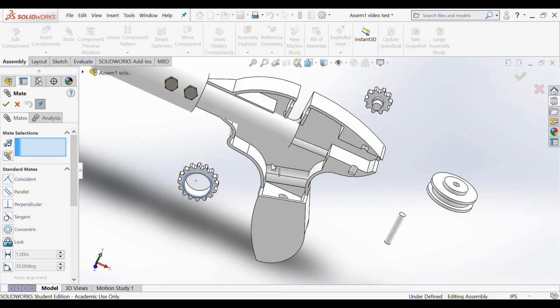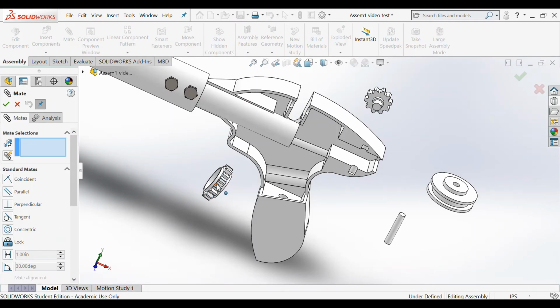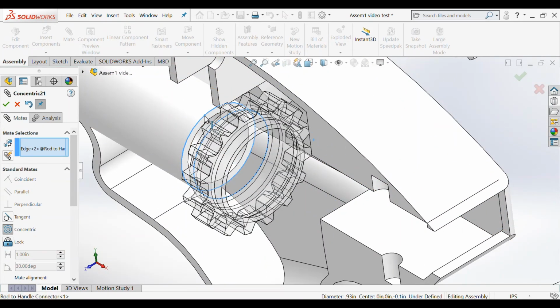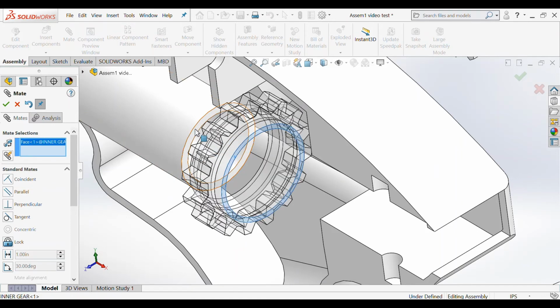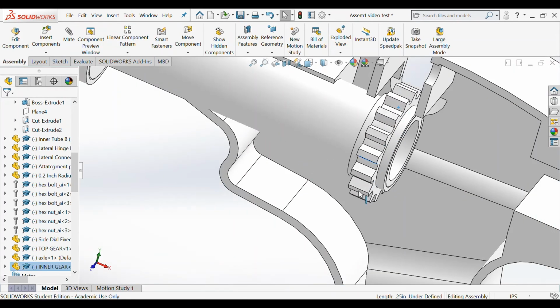So first I'm going to move this component and rotate it for easier mating. Next I'm going to mate the inner circle of the gear to the outer circle of the rod. I'm going to make them concentric. And then I'm going to choose the outer face right here of the gear and the outer face of the tube. I'm going to make them coincident. So as you can see, this gear can still rotate, but it can't move left or right.